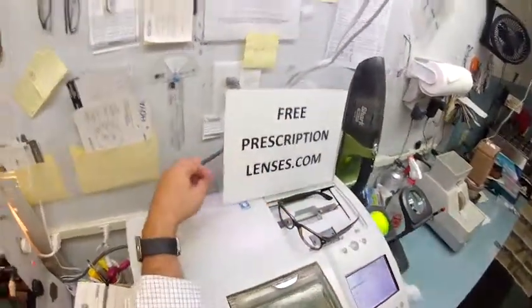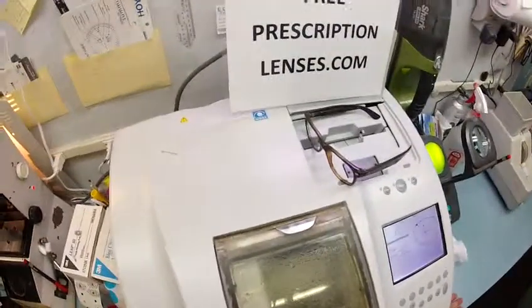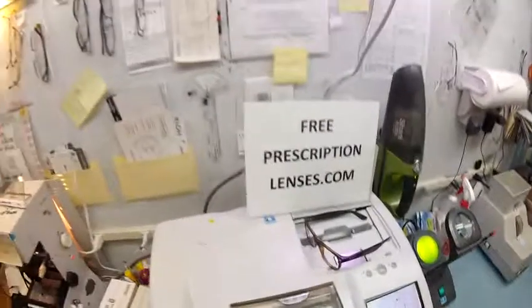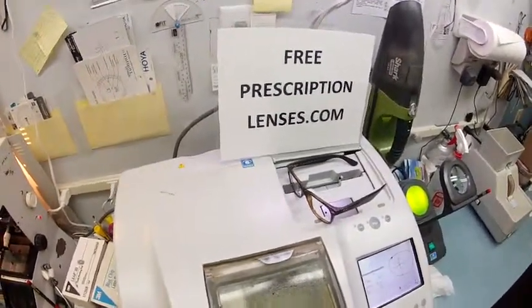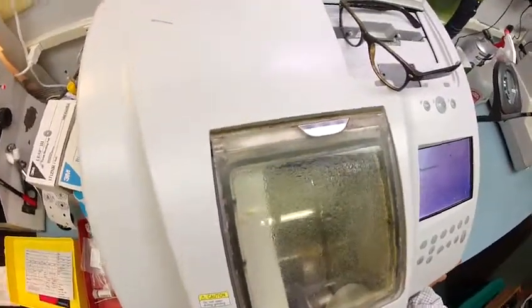So, Jeff, if I were to hazard a guess, I would say you're between the ages of 43 and 46. Am I right? That's what a 150 power does. You're about a 1.25 in your early 40s, a 150 in the mid, and a 175 in the late 40s. I'm in a 175 myself because I am 47 years old.